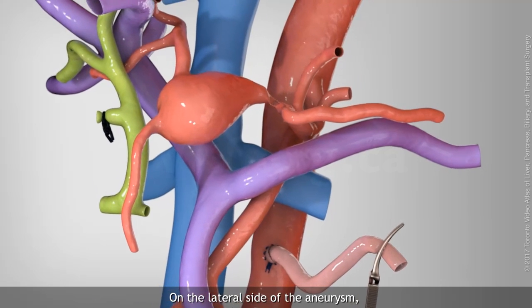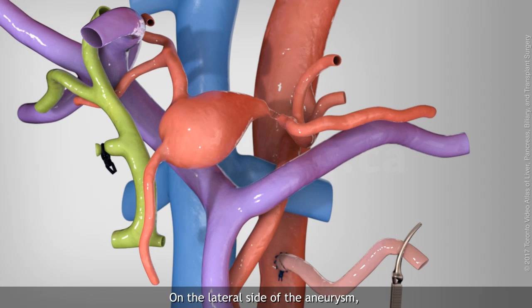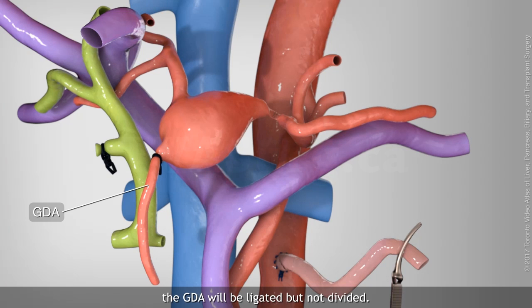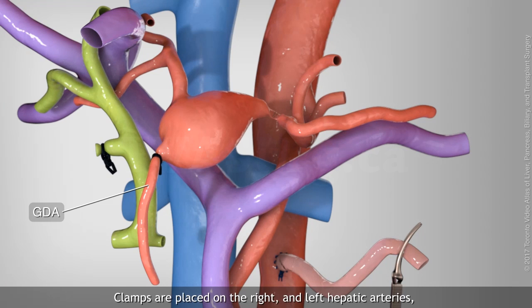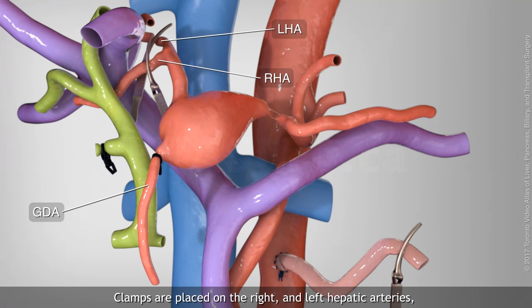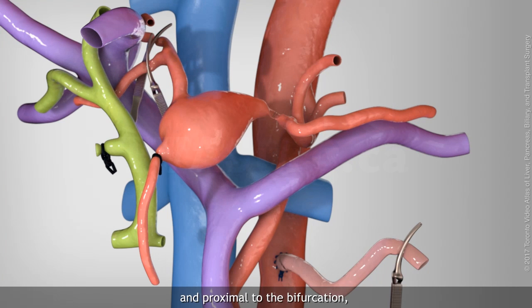On the lateral side of the aneurysm, the GDA will be ligated but not divided. Clamps are then placed on the right and left hepatic arteries, and proximal to the bifurcation.